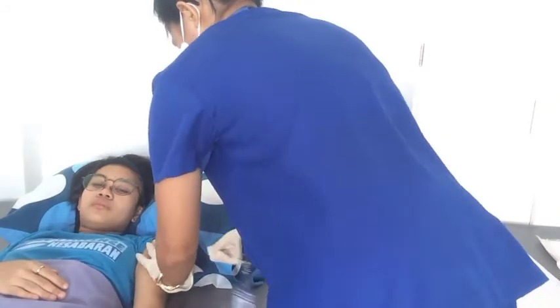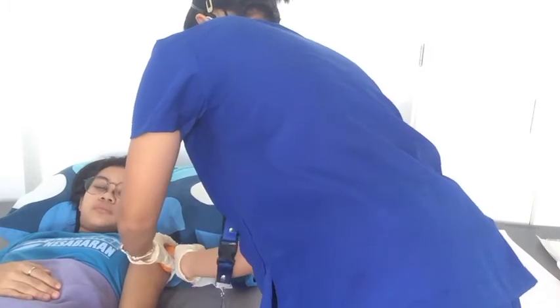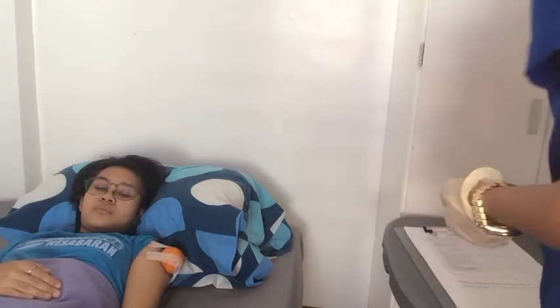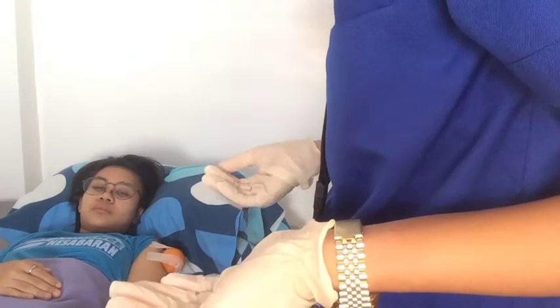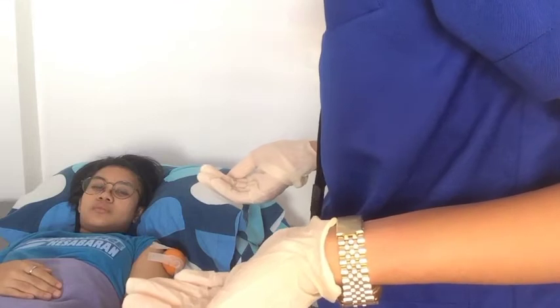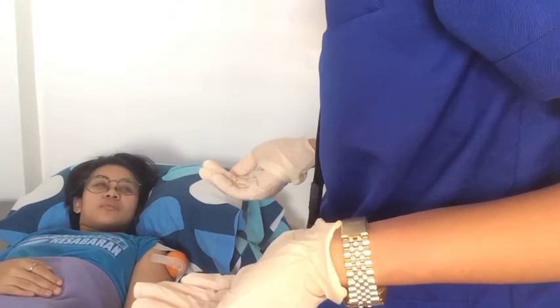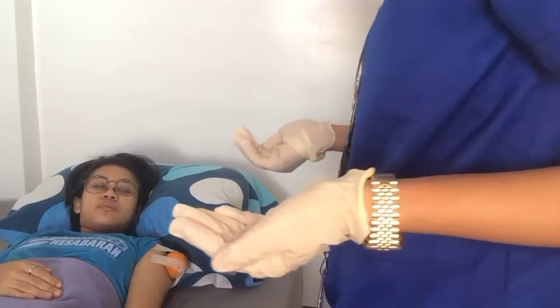Ma'am, may I just straighten your arm? So my patient here is lying in a supine position. Next is transfer and hold the swab between the third and fourth fingers of your non-dominant hand in readiness for needle withdrawal, or position the swab on the client's skin above the intended site. Allow the skin to dry prior to injecting the medication.